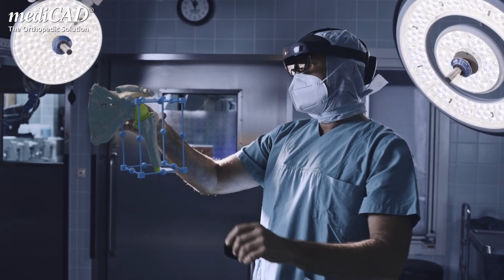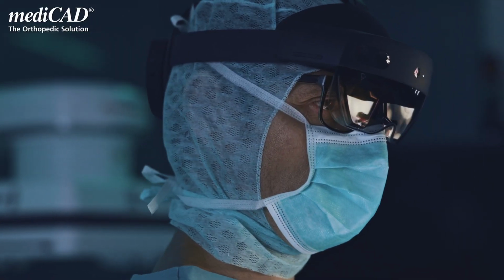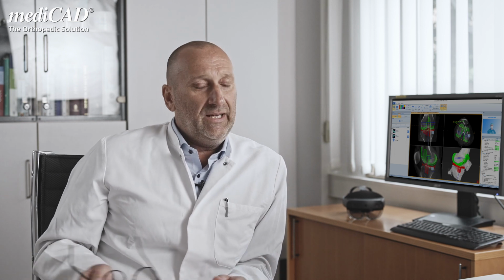Of course, in the beginning I had doubts regarding HoloLens because of the references I read online. For example, I heard about seasickness and nausea. I heard about usage issues. And I was afraid that the HoloLens would bother me during the surgery. However, after testing, I couldn't understand all the concerns.